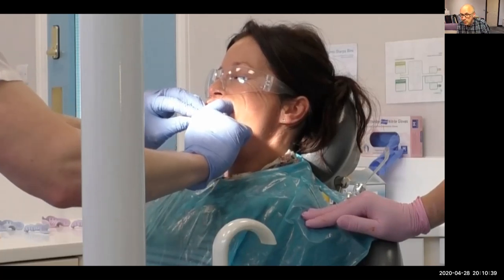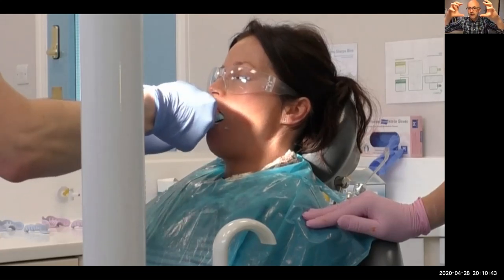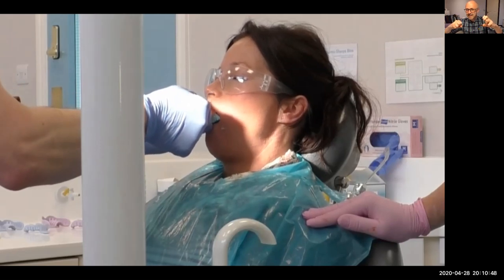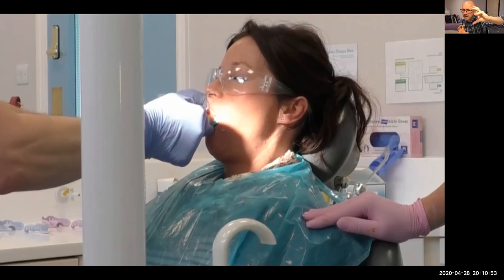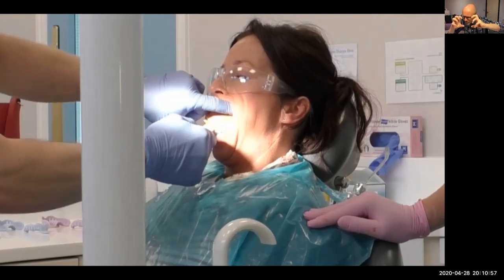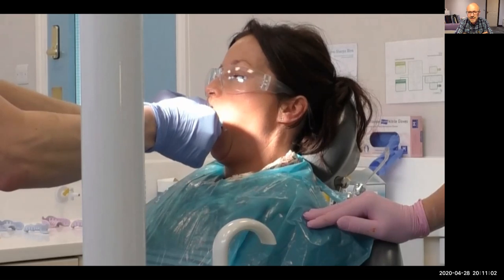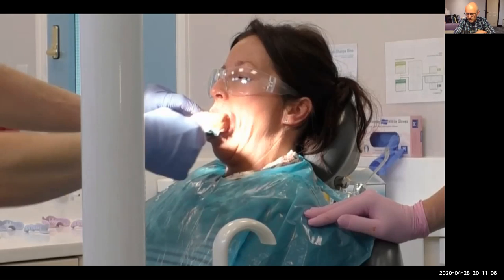But what I'm doing is I am thinking about pulling that tray down the long axis of the teeth, drawing it down and just giving it a little wiggle, getting my fingers around the border and pulling it down quite firmly along those long axes of the teeth there. And Claire's just reassuring you. It's just constant reassurance that we give the patient. It's really important to help them remain relaxed.